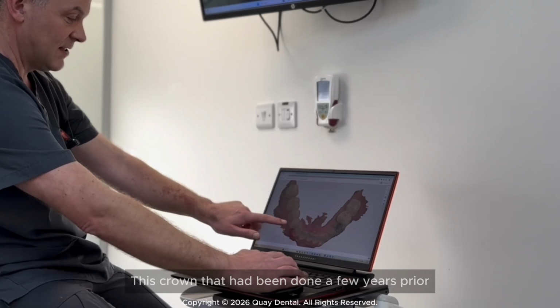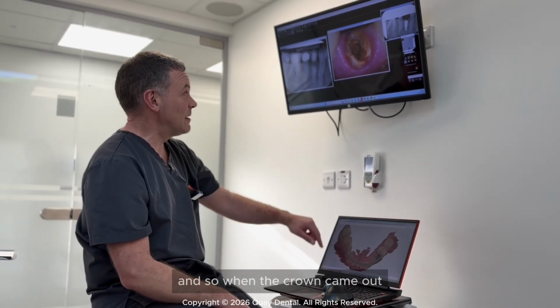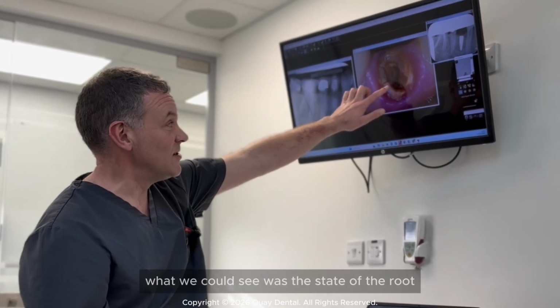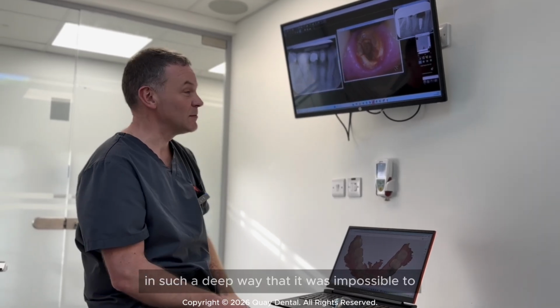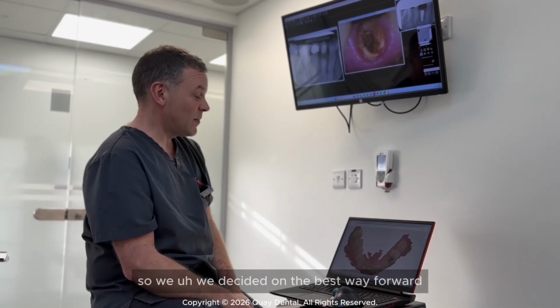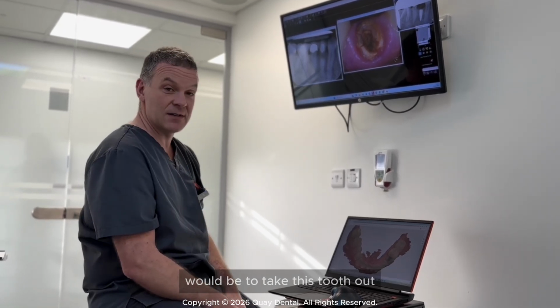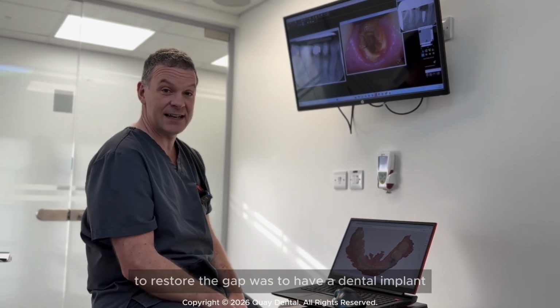This crown that had been done a few years prior has failed. So when the crown came out, what we could see was the state of the root. We could see that it was clearly fractured down in such a deep way that it was impossible to put that crown back again. So we decided the best way forward would be to take this tooth out, and for John the best option in the long term to restore the gap was to have a dental implant.